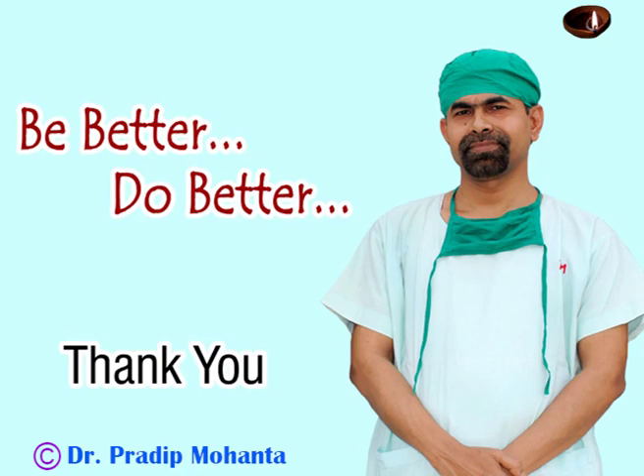The anterior chamber is formed and the case is closed. Thank you very much for watching. Hope this video will help you in developing your surgical skills. Be better and do better.